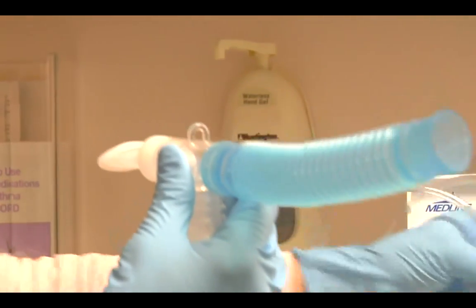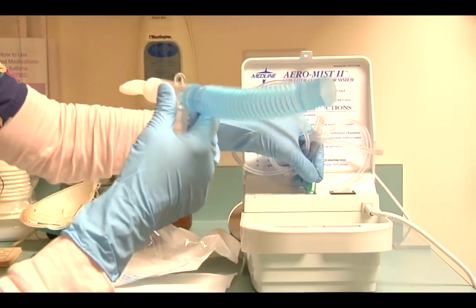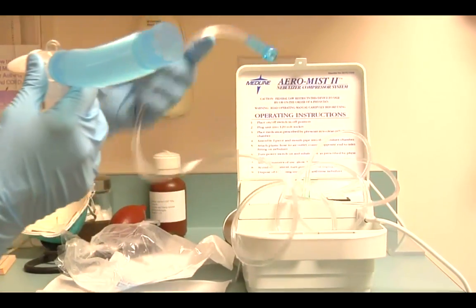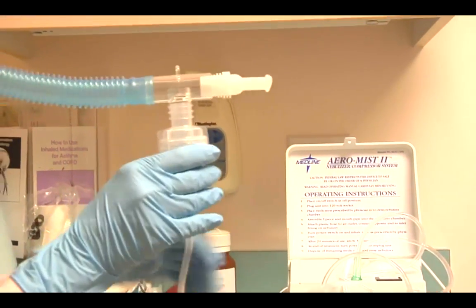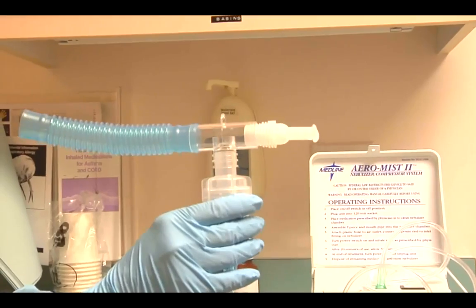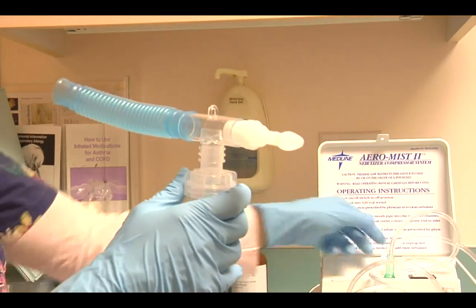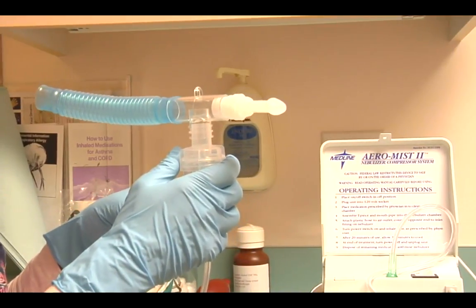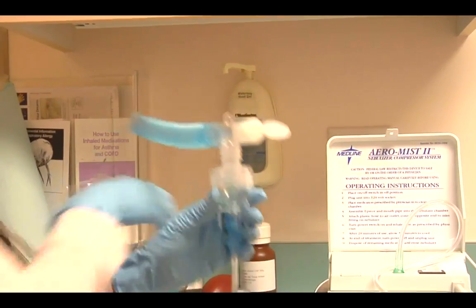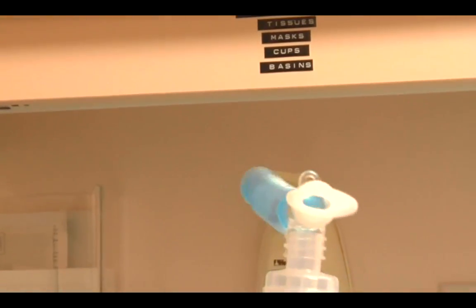We're now going to assemble the tubing, which has a connection on the nebulizer machine as well as the tubing. We're going to make sure everything is tight. Oftentimes we'll check that the mouthpiece is comfortably situated to go directly into the patient's mouth so that it's straight. Then all we do is go ahead and turn the nebulizer on.